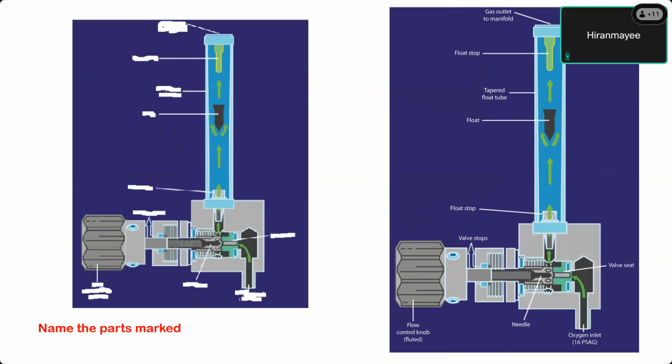Safety mechanism, sir, to prevent hypoxic development. Even if no power or lighting is there, by touching it you can identify whether it is the oxygen knob or the nitrous oxide knob you are using. Okay, so that is not to control the hypoxia, it's to give you control over the knob. By touching over a period of time, when you touch the knob itself, you should be able to say whether you are touching the oxygen knob or the nitrous oxide knob.